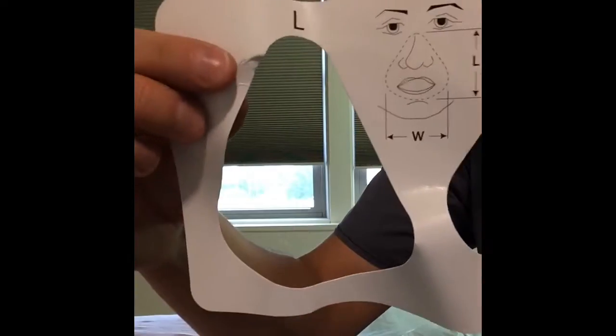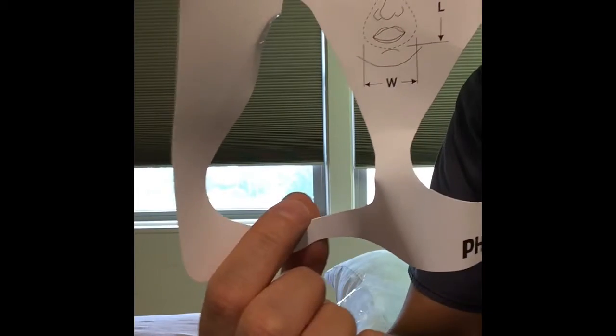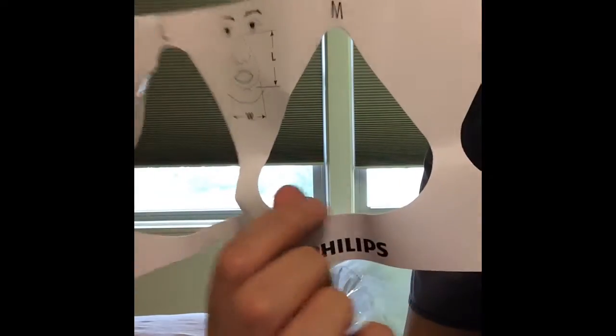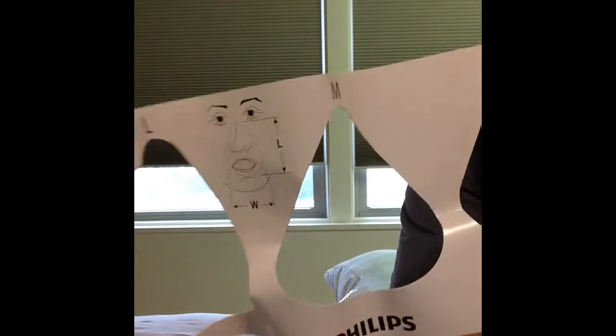So what you're going to do is hold this up to their face. If the bridge of their nose fits in here and the bottom piece goes in between their lip and the bottom of their chin, then you've got a good sizing mask. If at any time this bottom part is up on that lip, it's too small of a size. You need to go up to that larger one.